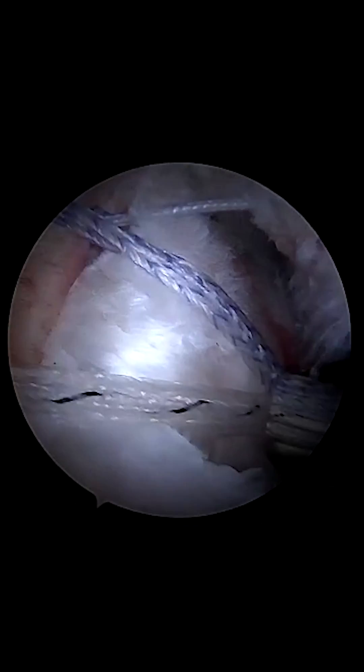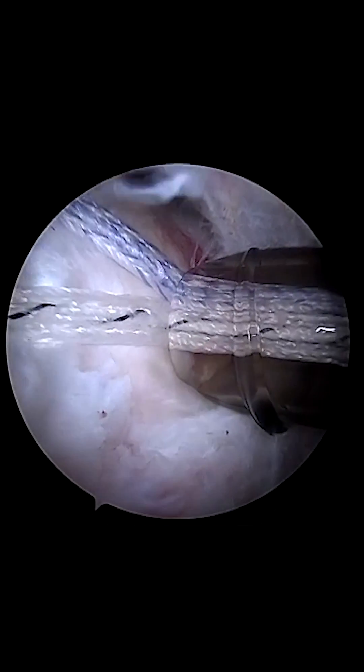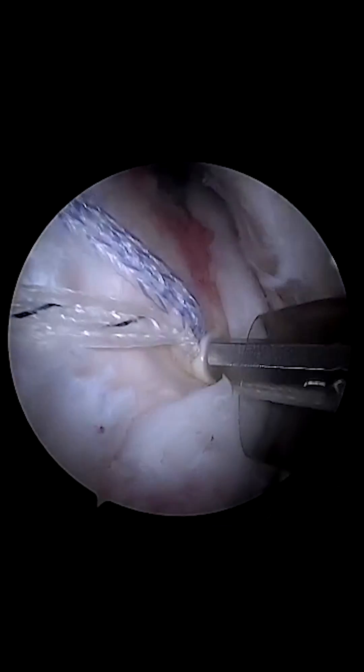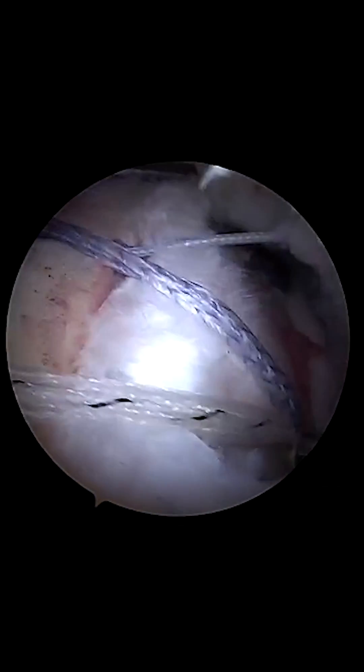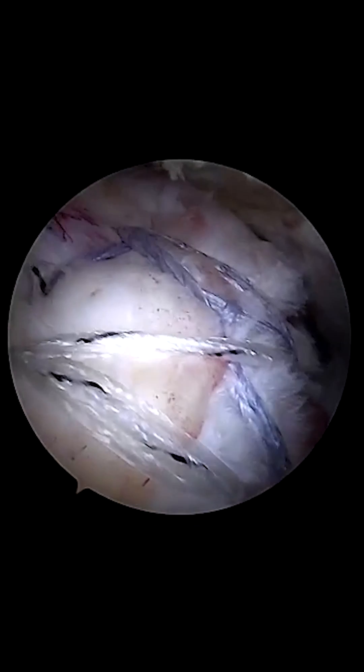Now we're using our double pulley suture with the knotless swivel lock medially. Then once we go over and place our lateral anchors, the tear is essentially reduced for us. We don't have any slack hardly to get out, and there's our final repair.